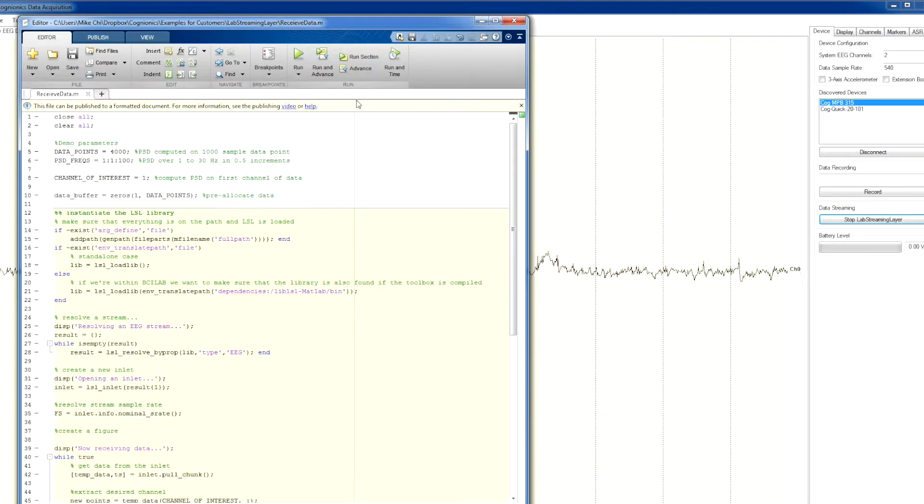Now let's go over to a simple MATLAB script that reads the raw data and computes the real-time power spectral density.